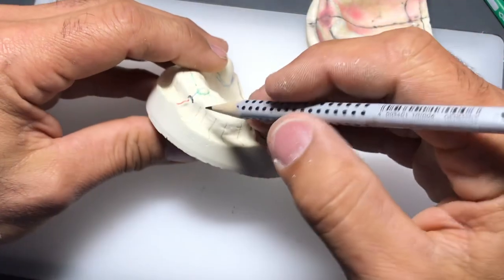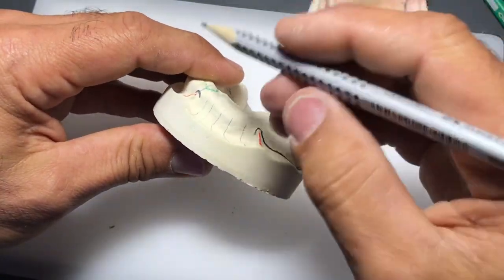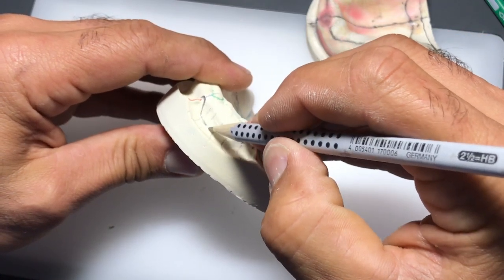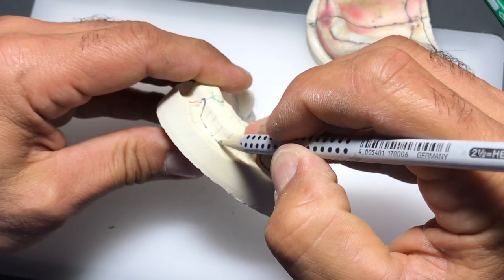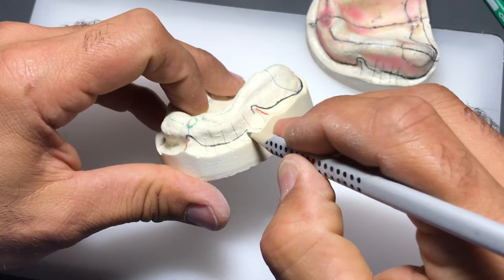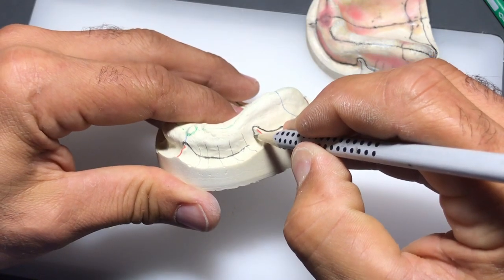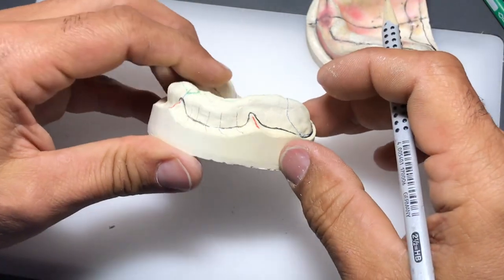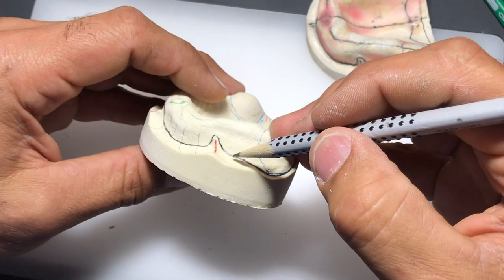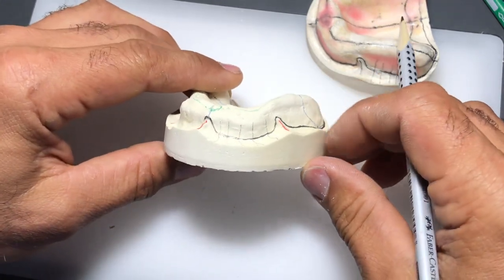Holding my model anchored to the bench at about 45 degrees, I'm trying to scribe a line on my cast by going back and forth with my pencil, and that'll take you to the deepest point. Notice that when I go around the frenums it's a very gentle transition - nothing is sharp, nothing is straight. There's nothing about human anatomy that's straight, so let's keep it that way in everything we do.